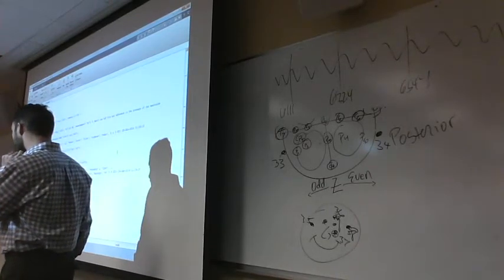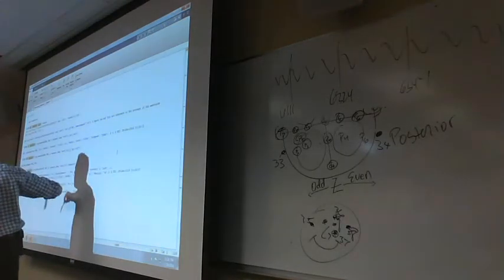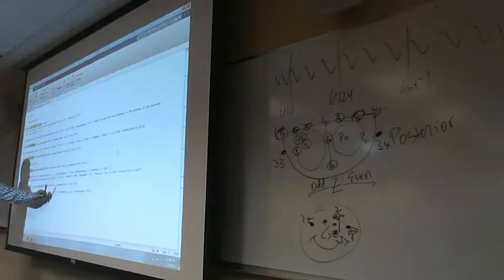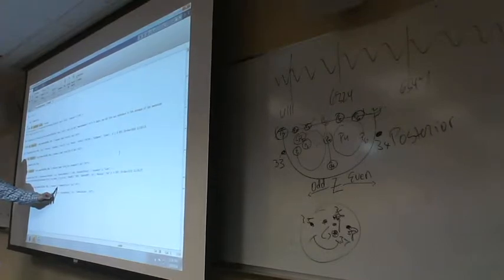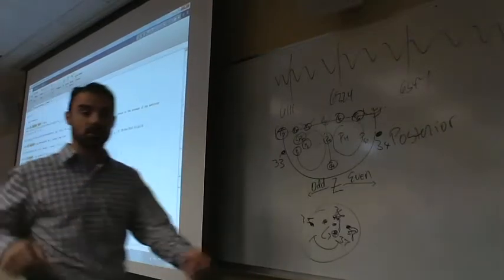Yes. Are you editing the loop? I'm not editing the loop. This is within the loop. I'm adding more steps to it. Okay? So one thing that we might need to do is you're going to have to update this number to add that num2str aspect to it, just like we did with the brackets. You're going to have to add the bracket and the num2str. Okay? So that's one thing that we can do here.